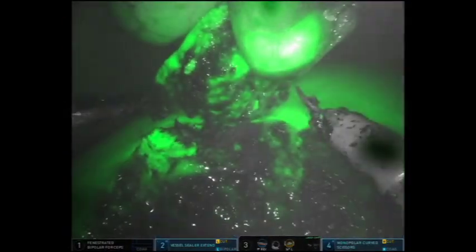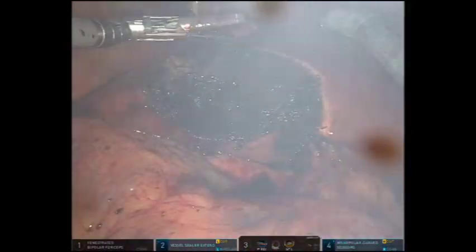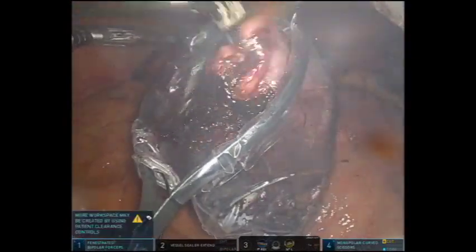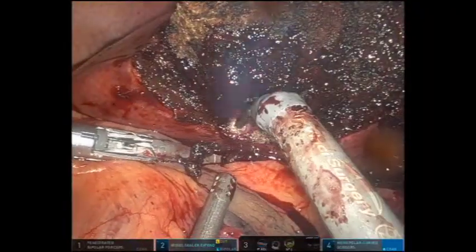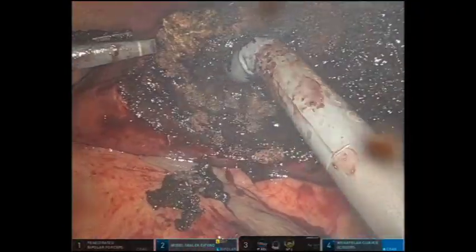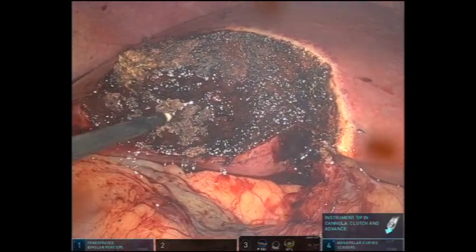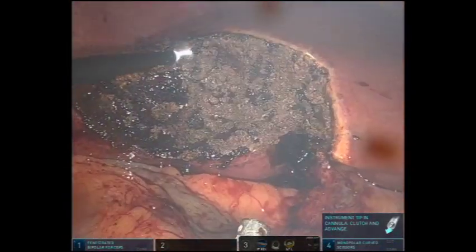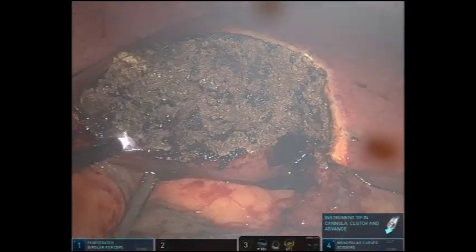Fluorescence angiography is utilized to assess the margin and there is no evidence of tumor. The specimen is placed into a pouch and into the left upper quadrant of the abdomen. The argon beam is then used to cauterize the liver bed.